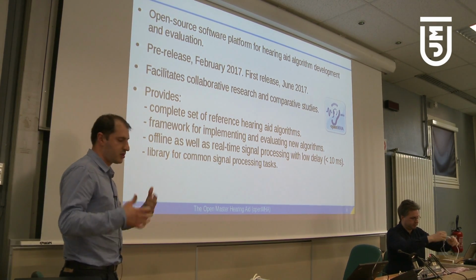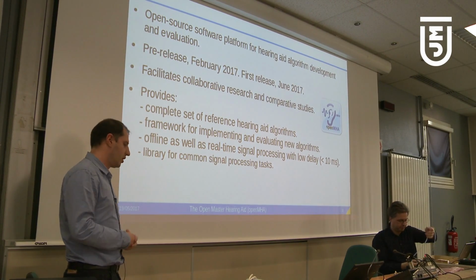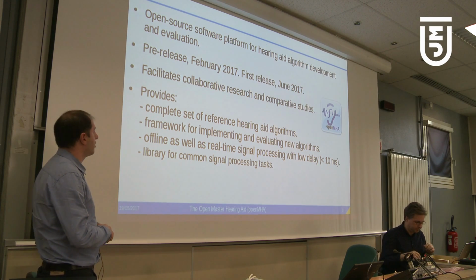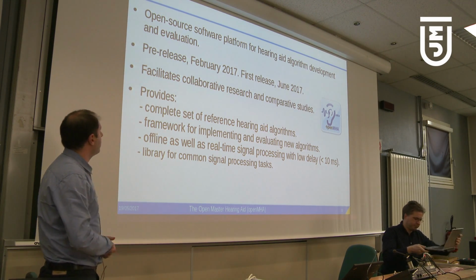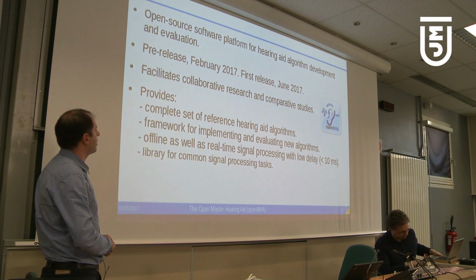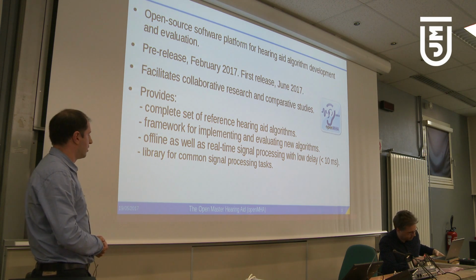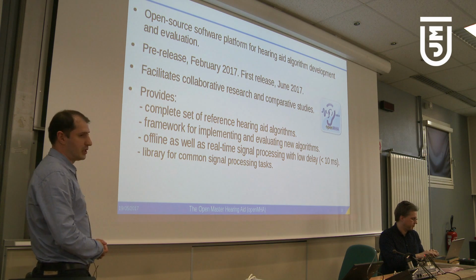It's a real-time audio signal processing platform, which is mainly geared towards hearing aid algorithm development. We had a pre-release in February with basic functionality, and we expect to have a full first release in June, which I should mention runs in Linux.